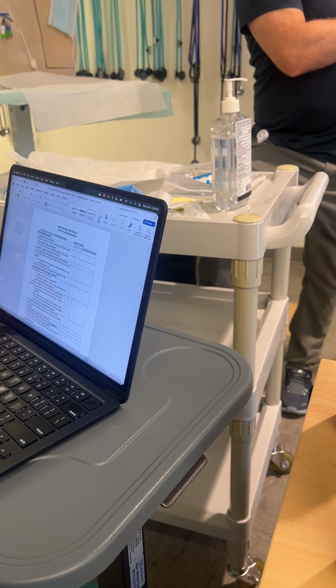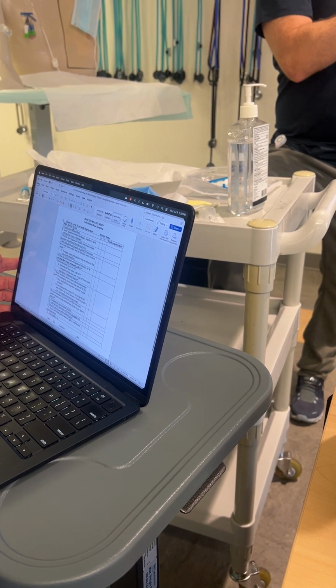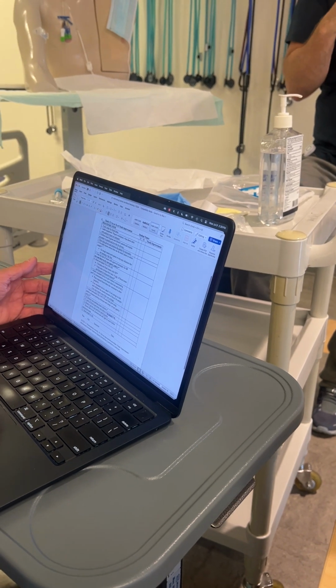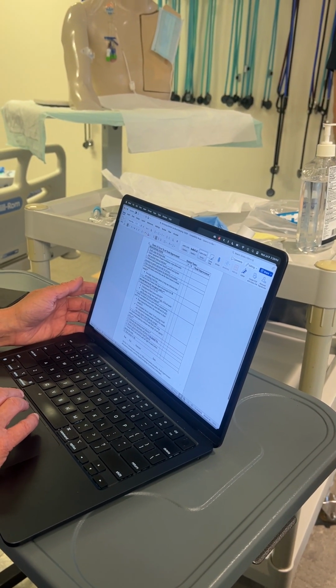I'm going to throw something on the PowerPoint that's like order of draw, because I don't think we have anything in there that would say that. I think you got it in. Do you have it in the ID? Lavender's last, I can't remember, because that has EDTA in it. Because it has a lavender last.